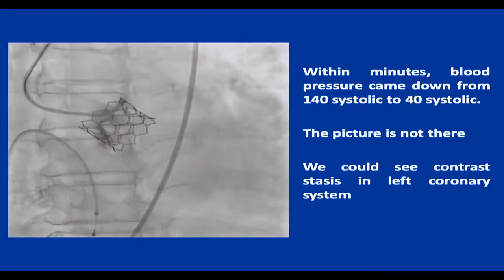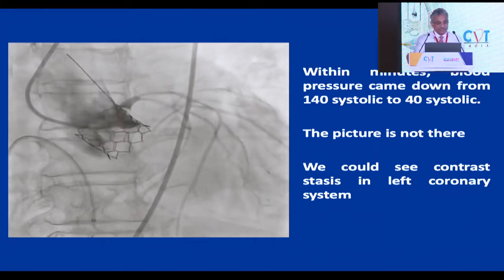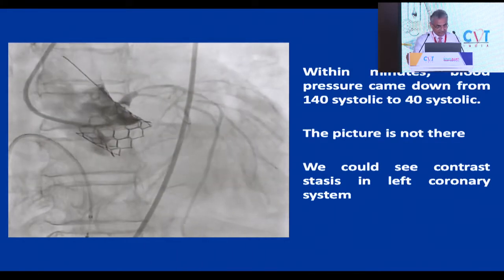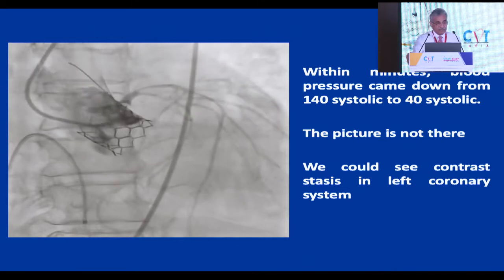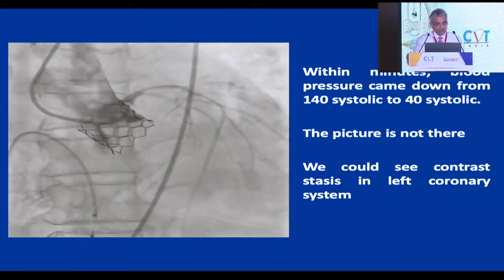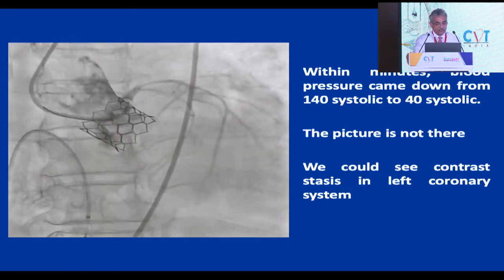Within minutes, blood pressure came down from 140 to 40 systolic. We could see some staining on the left system. The dye was staying in the circumflex. The picture could not be taken because it was a very bad situation. The patient was crashing right there on the table. As we already had the guide and everything on the table, I could quickly go there.